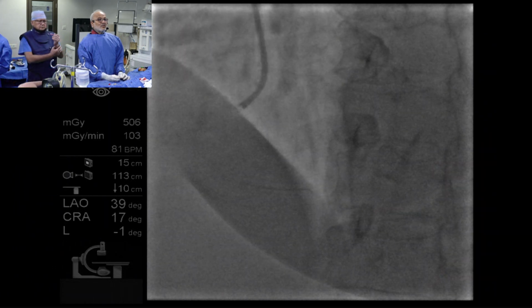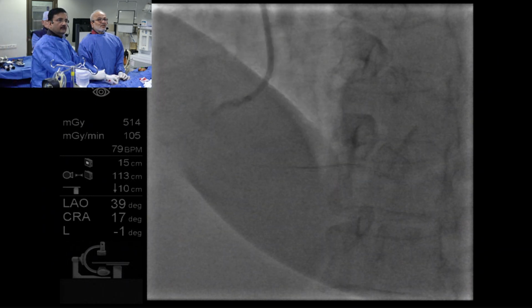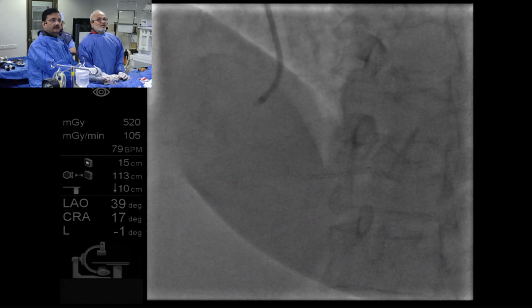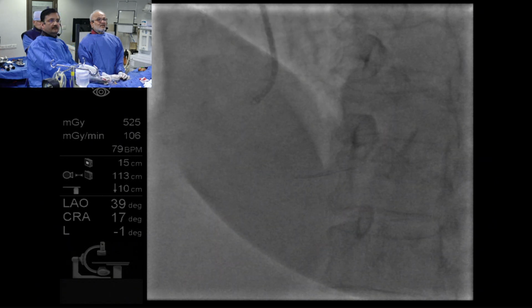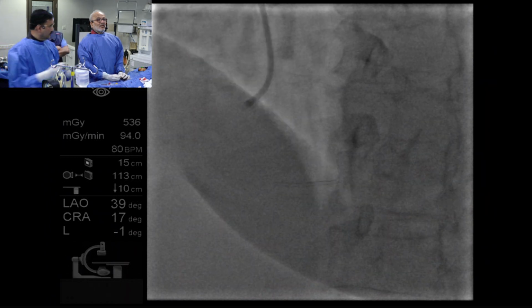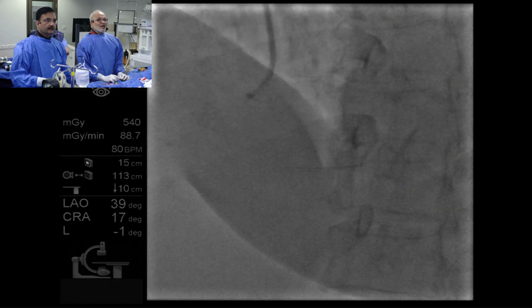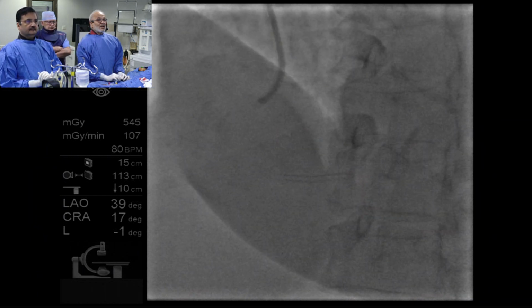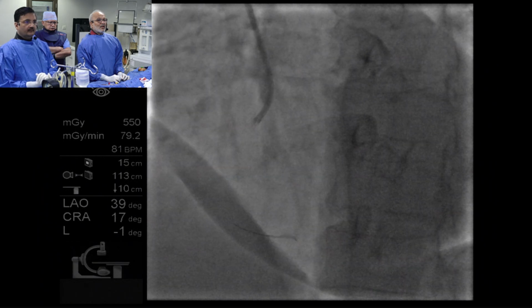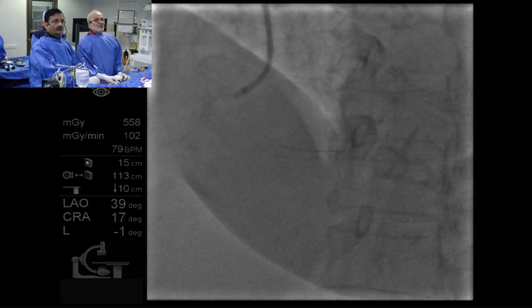Scout. Sanjay, this is a very uncoated wire, stainless steel. Sanjay, by and large, this torquer does not work. Okay, let me see. So your experience of Rota Pro versus the routine Rota that we've been classically using? This is routine Rota. Rota Glide, I have no experience. Scout.